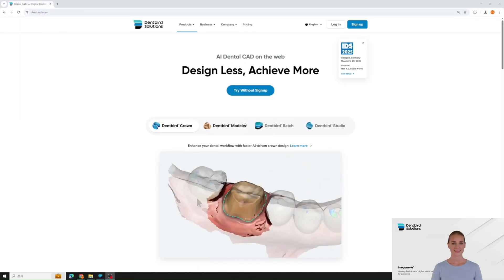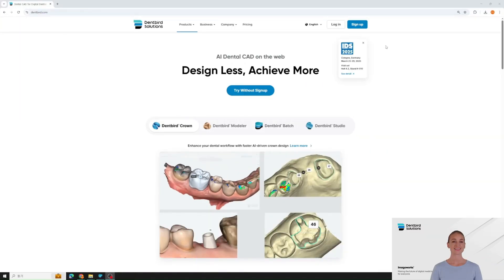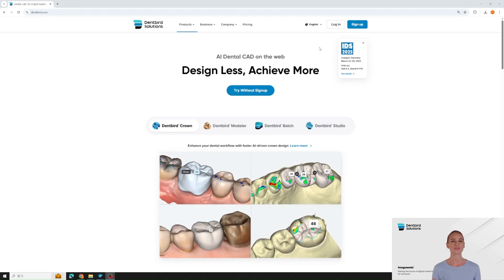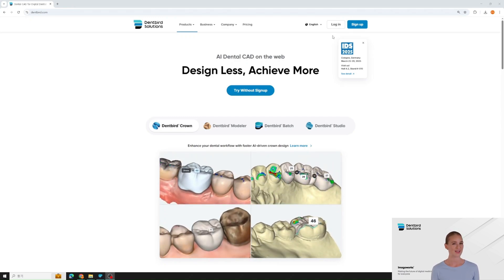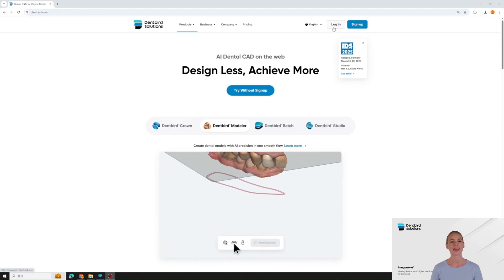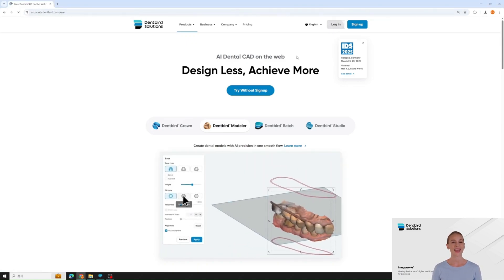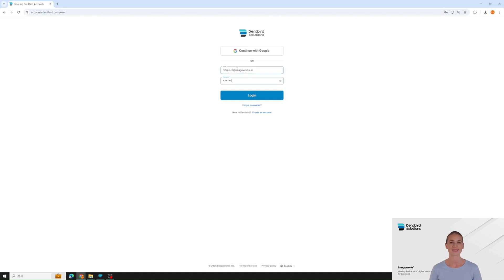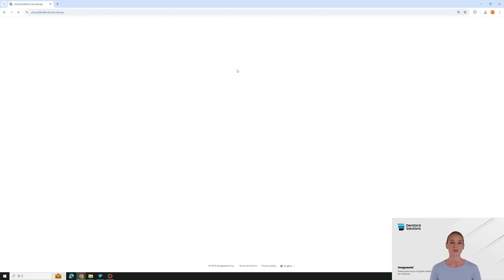How do you get started with DentBird? It's simple — no installation required. Just visit dentbird.com and log in. That means you can access your designs anytime, from anywhere. And since DentBird is cloud-based, your case list is always accessible — no need for external drives or local storage.